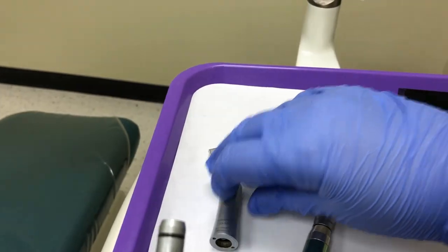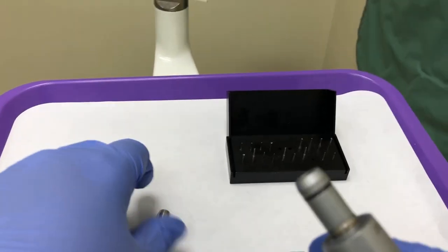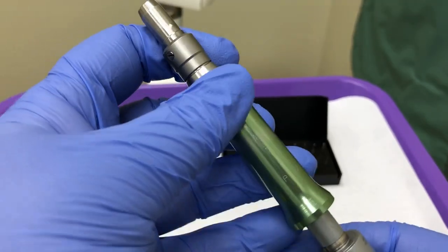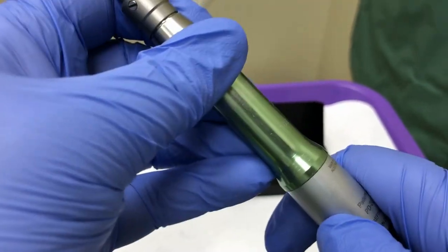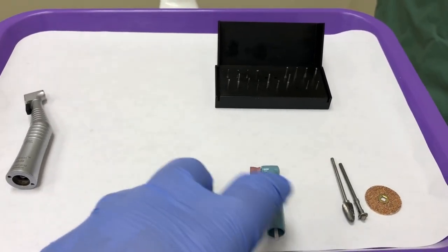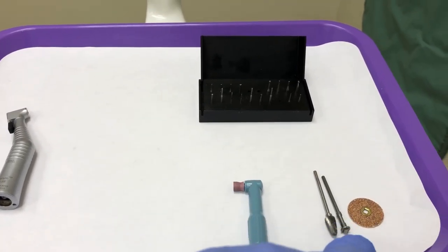The next example shows the straight attachment being attached to the low-speed motor. Several items may be attached to the low-speed motor with a straight attachment, such as the prophy angle, the laboratory burr, or the mandrel and disc.